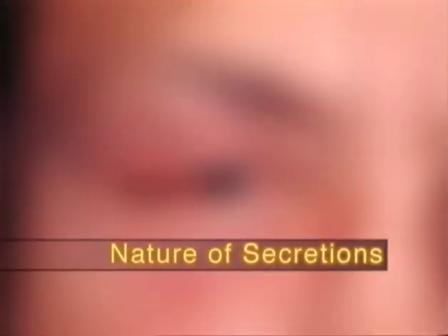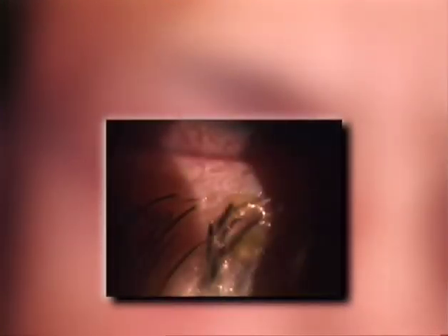If we analyze the nature of secretions in chronic conditions, we may distinguish between homogeneous liquid oily or semi-fluid material, which indicates a continuous hypersecretion, and non-homogeneous material, which indicates secretion either in an irregular sequence or intermingled with material of different consistencies.